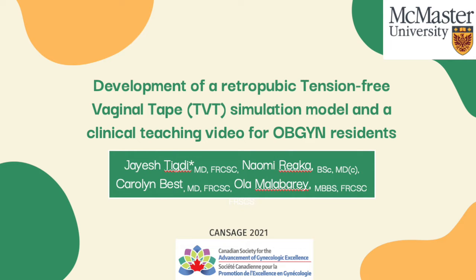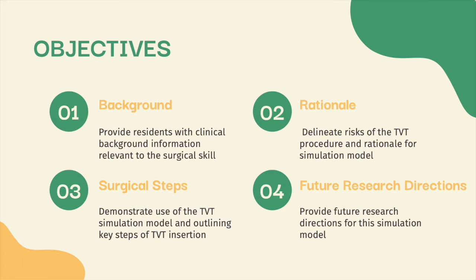In this video from myself and colleagues at McMaster University, we describe the development of a retropubic TVT simulation model and its use via a clinical teaching video for OBGYN residents. The objectives of this video are to provide background clinical information on the relevance of TVT insertion skill learning and the benefits of simulation for this surgery.